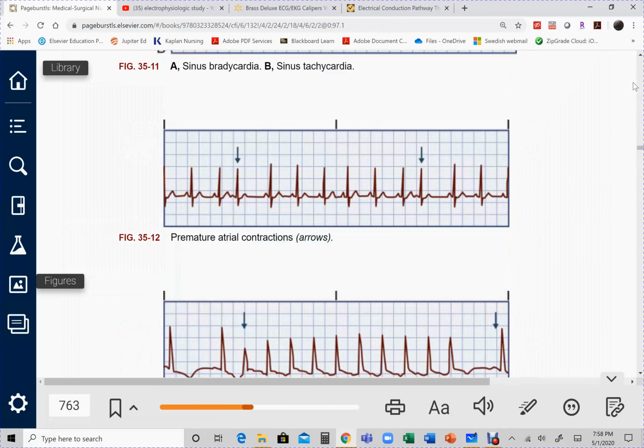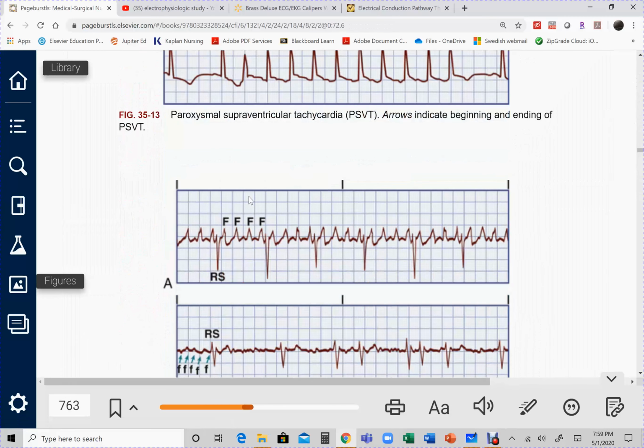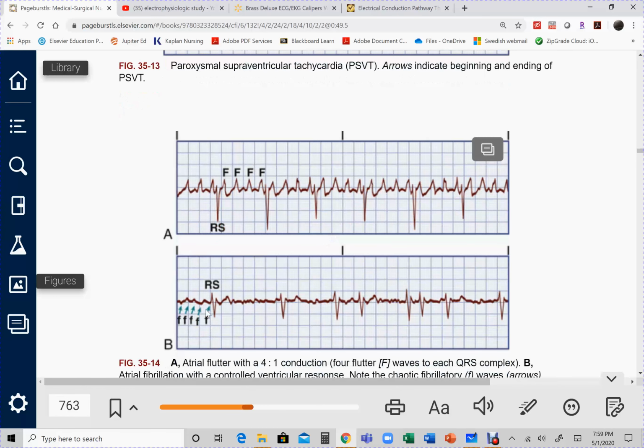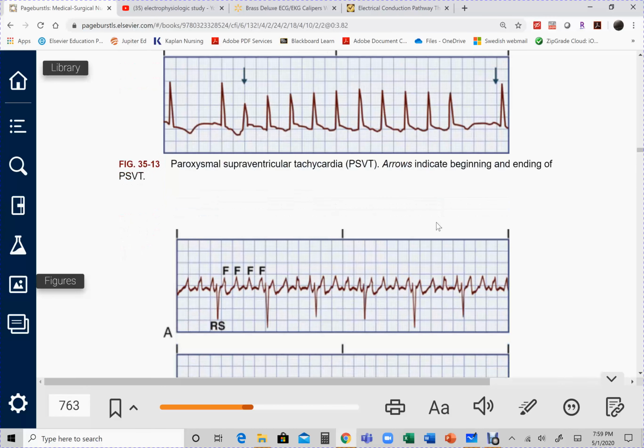Alright, here's Afib. This here is Afib. This is a flutter. So this is what I meant by the sawtooth appearance. It's very regularly appearing, so they occur in succession. This one's also Afib. No, it's not like the sawtooth. This one's more disorganized. Clearly, you don't see P waves, right? These are not P waves. These are not P waves. So that's Afib. No, sorry.